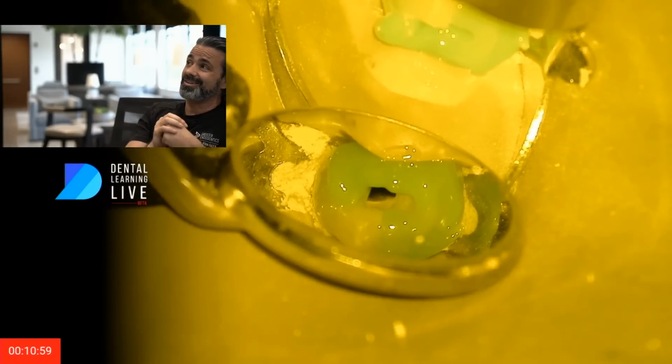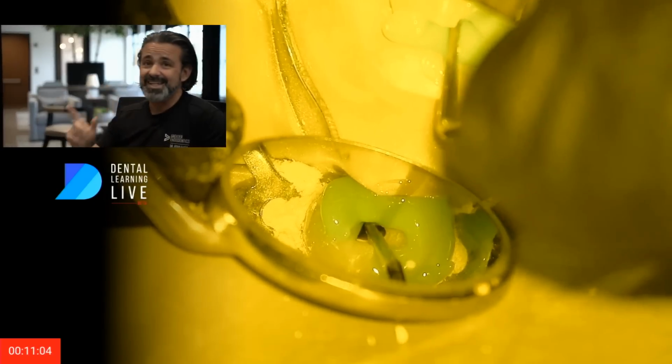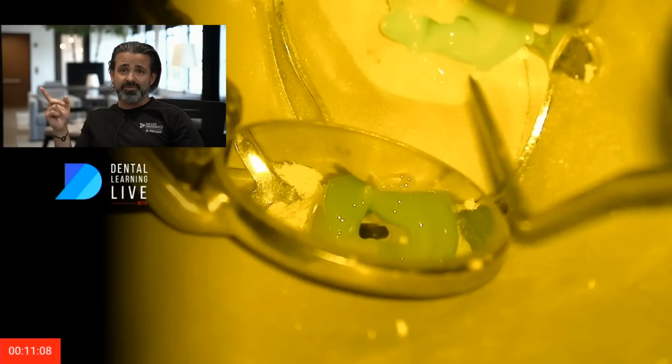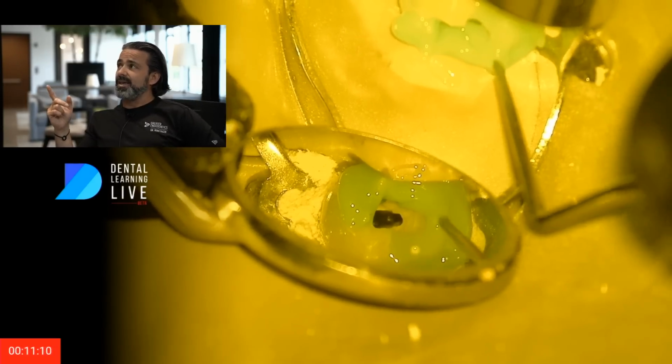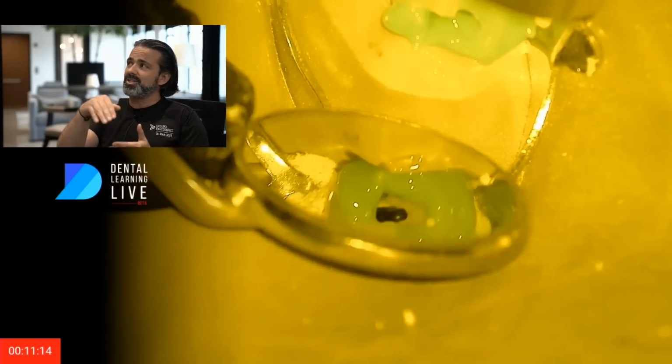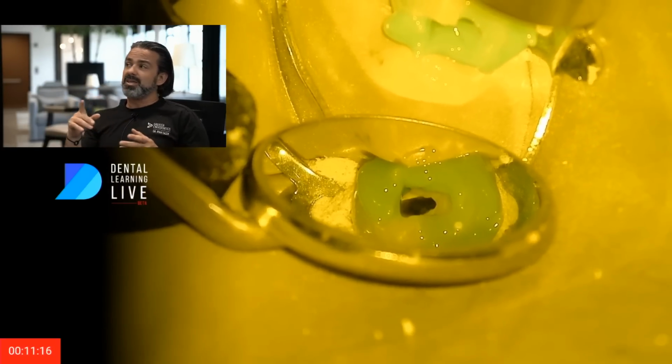And you know what? After doing the number of these, I don't know how many hundreds of these I've done, this is an easier way of doing it. It's taken me a while. So it's a little endo hack trick for you, a GentleWave hack. And then I'm taking an Explorer and I'm just kind of painting it and making sure there's no voids or bubbles. And you know, you kind of want it like that partial set.